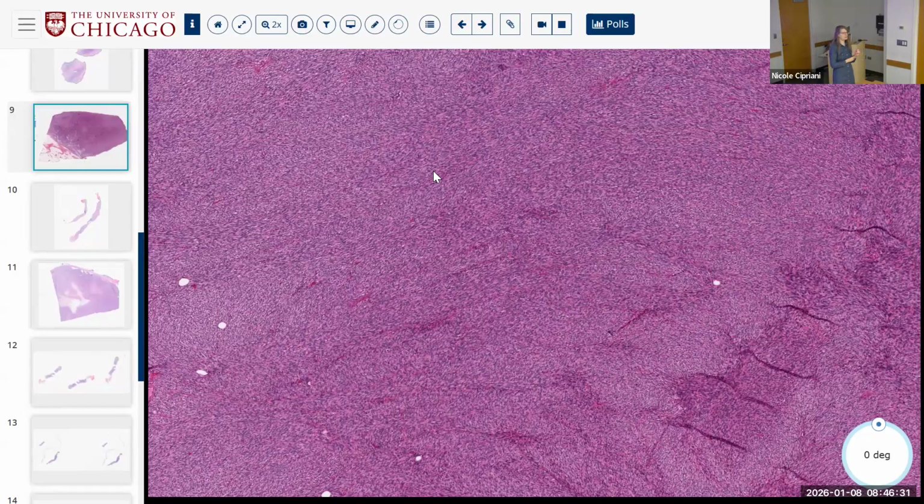Collagen, PDGFB, exactly. So yes, it would retain the molecular. If you only saw fibrosarcomatous area, which probably you wouldn't because there's usually always a background, that would be proof that it came from a DFSP. True fibrosarcoma in isolation like this, in an adult, either arises from a DFSP or is basically a variant of an undifferentiated sarcoma, if it doesn't arise from a DFSP.